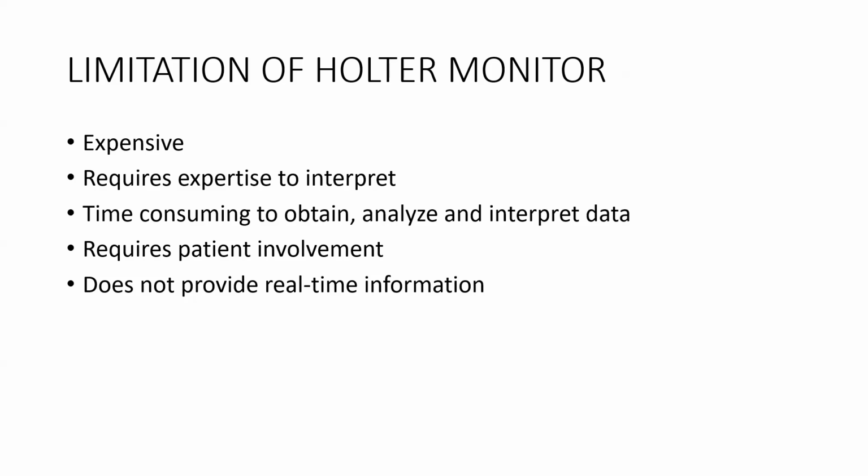Transmitted to the software. So it doesn't provide real-time. The next ECG monitor we will be talking about are the event recorders. So the post-event monitor was developed to overcome some of the limitations of the Holter monitor. The image shown on the left is the post-event monitor. The monitor is usually placed, as shown, on the chest wall during episodes of the event.